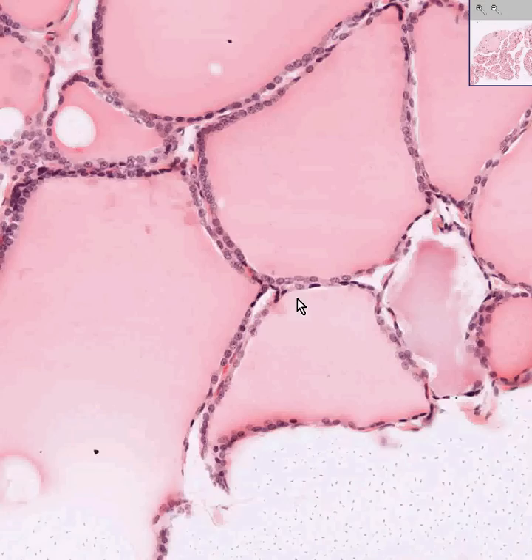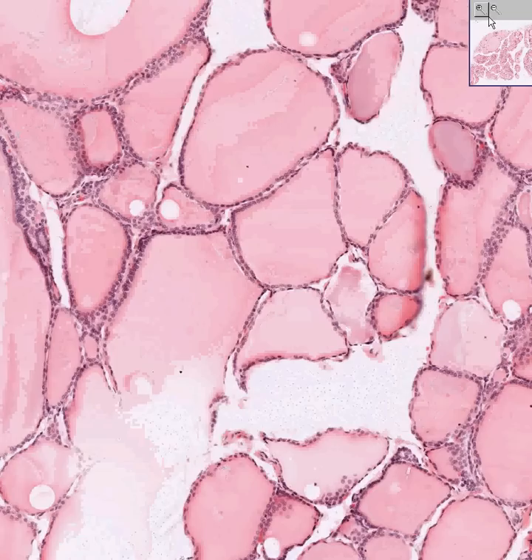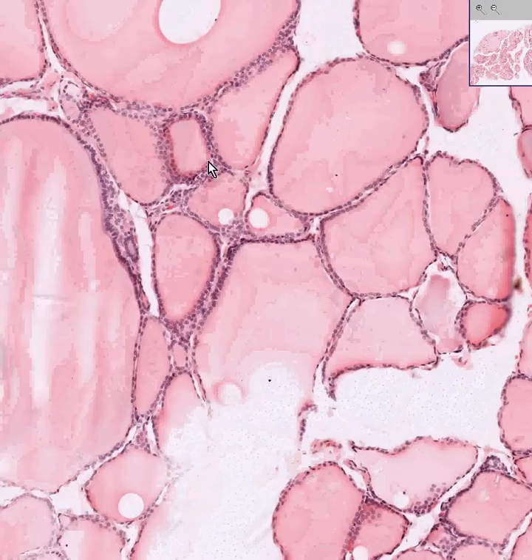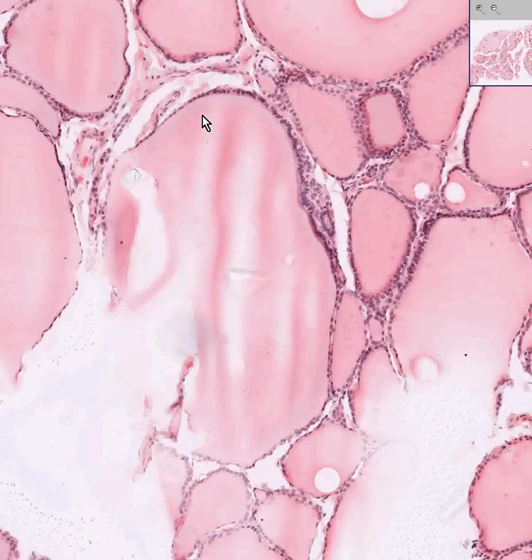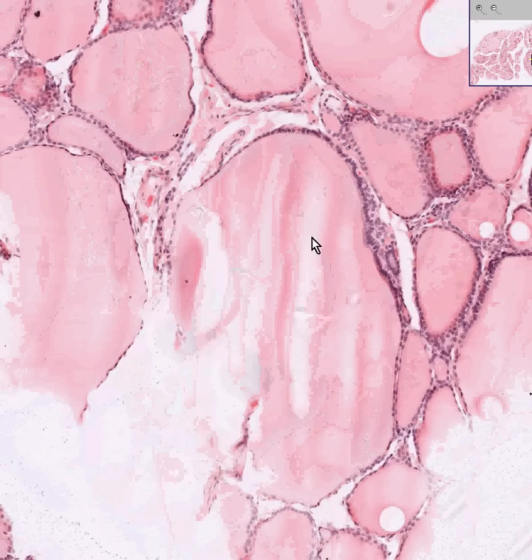Sometimes it's just called calcitonin, and the cells which make calcitonin are found in the little spaces between the follicles. They look like typical endocrine-looking cells — they'll have a little bit of pinkish cytoplasm and a round nucleus. These cells are called parafollicular cells, because the cells which make the thyroid follicles are follicular cells, so the parafollicular cells are in the space between the follicles. Sometimes they're called C cells, sometimes they're called light cells.